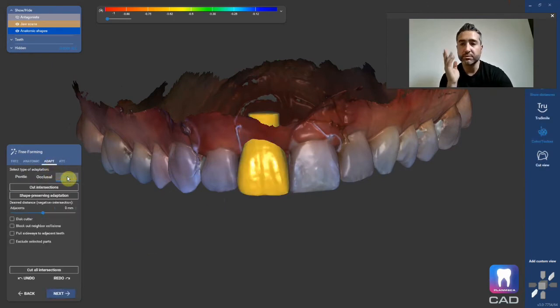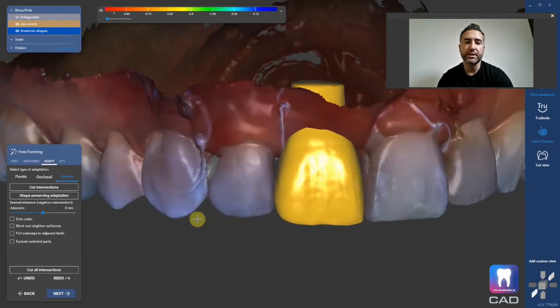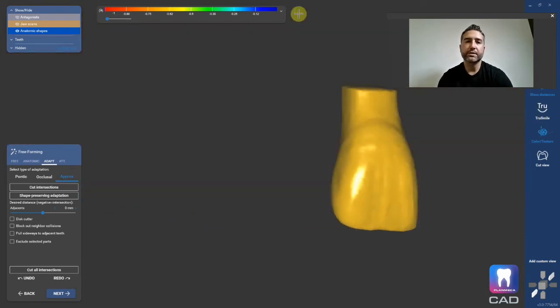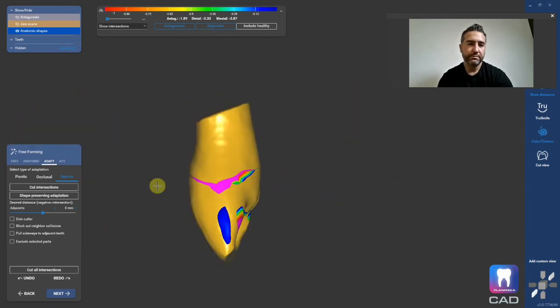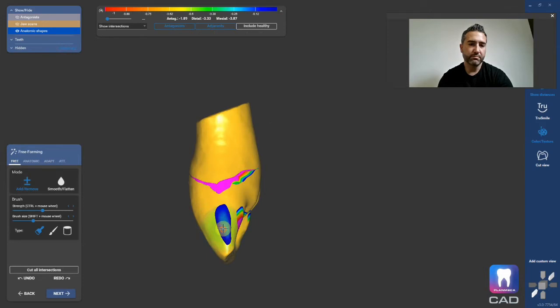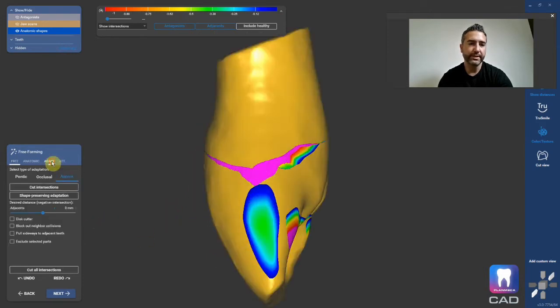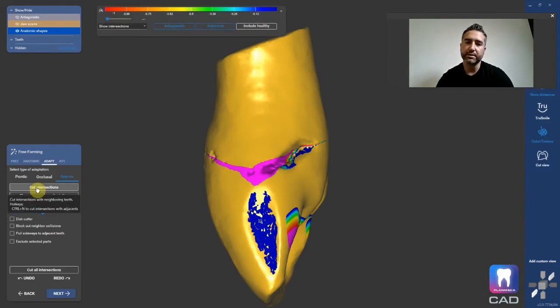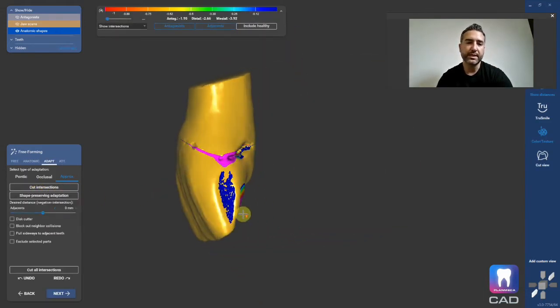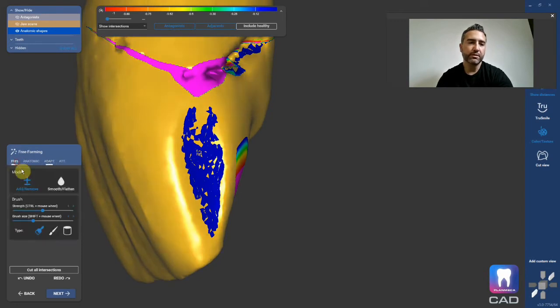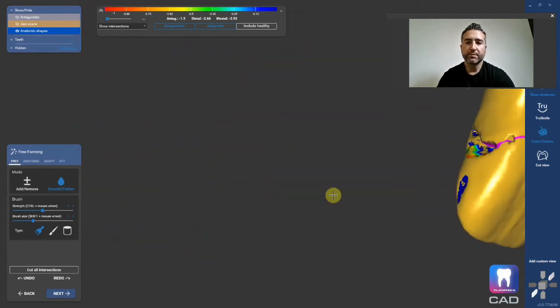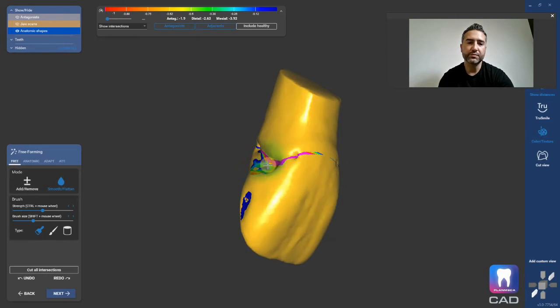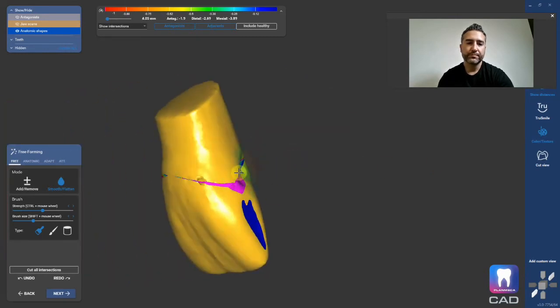Now we're going to go to adapt approximal and cut those proximal contacts. Let me show you what it's doing. If I turn on adjacents, that's actually not a bad contact there — let me make it bad. Okay, that's too heavy. So if I go to adapt, cut intersections, it's going to cut it and make a perfect proximal contact. If this is concave, I'll go here and smooth from the sides to make it not concave. That blue color is what you want. Just smooth this up here.